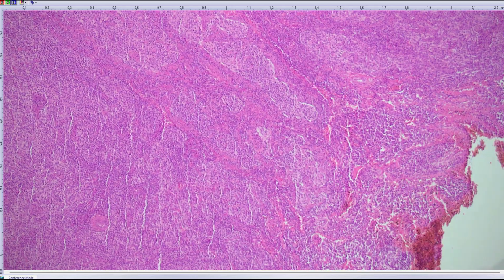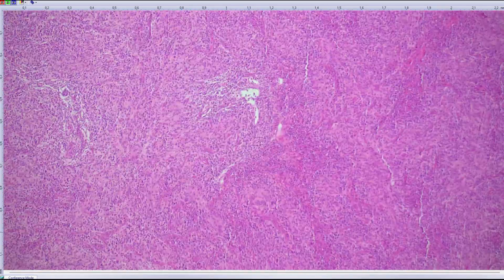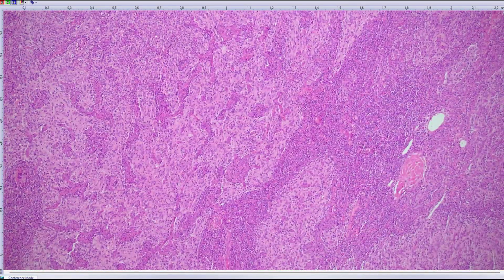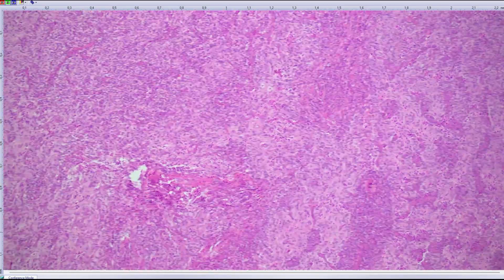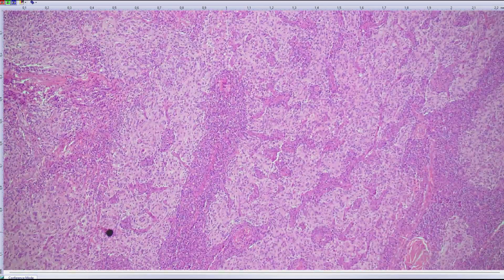Yeah, and I have here an amazing patient that we followed here for several years, 30 years ago. I found the material, so I take it out. We even published the case in Zentralblatt für Pathologie. It was an East German journal.